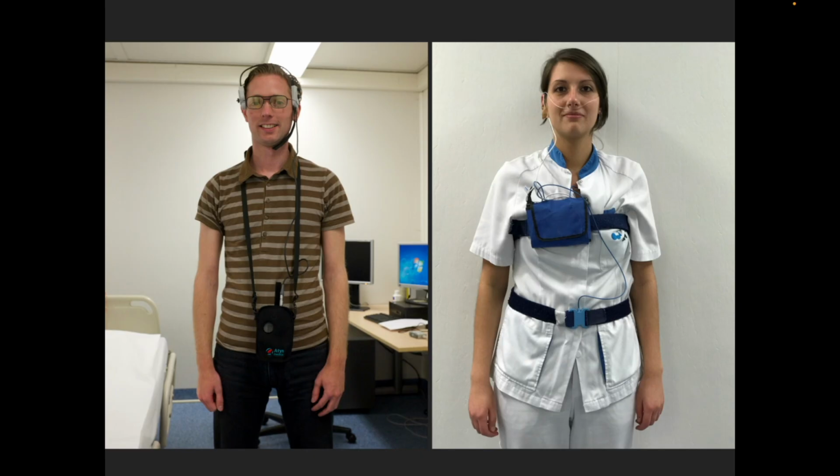One solution for this problem might be a long-term recording by an ambulatory device. We can see here a volunteer wearing the system. The transducer is attached to a set of glasses. On the other side of the glasses there is a counterweight.